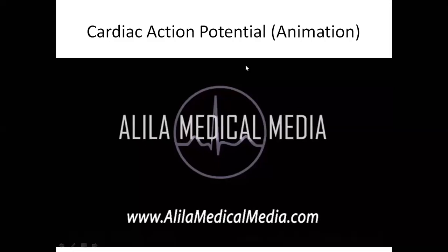So after that, what needs to be done? Then this SA node function should be restored. That means some external pulses should be given to the heart to run all the functions of the heart smoothly. So in that case, we need to install an external pacemaker or external pulse generator.